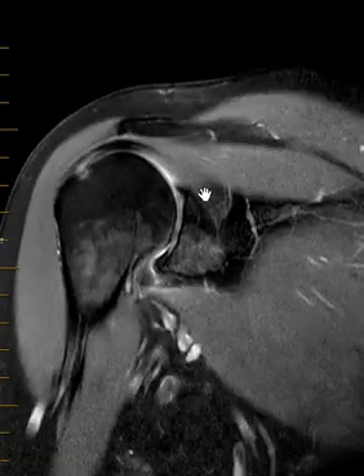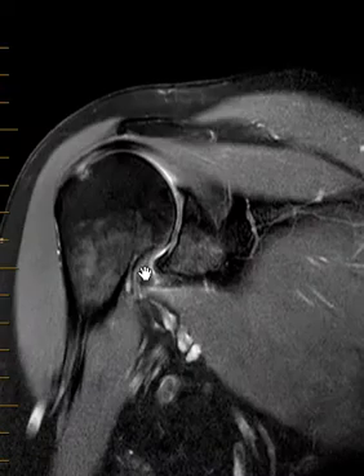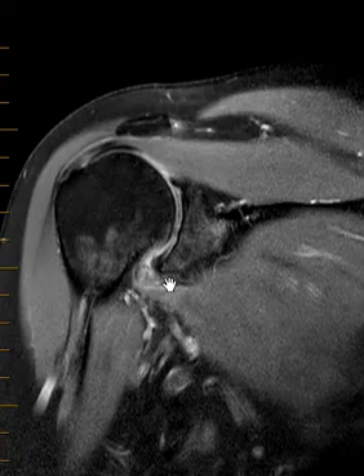If you did not have an obvious labral tear — here's your superior labrum, here's your inferior labrum. The only thing we see is down here along the inferior joint capsule. This is posterior. Things are pretty dark and relatively normal. If we go to the midline cut, this does look a little bit too thick and a little bit too bright on the PD sequence.